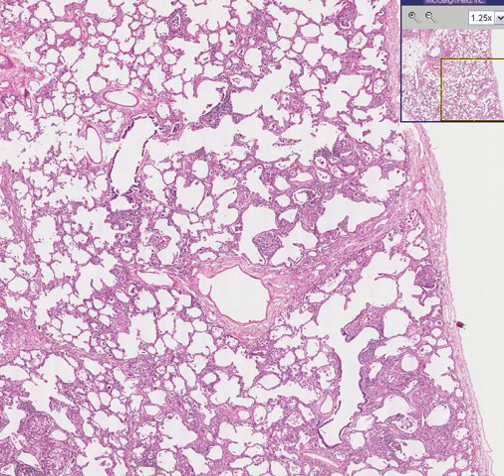What can we say about this section of tissue? I think instantly from our broad experience now, we can see that it's a lung. I think we can see that there are plenty of wide open alveolar spaces here. I think we could appreciate a nice, uniform, thin, fibrous pleural surface.